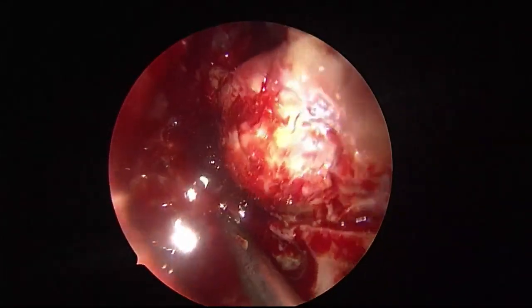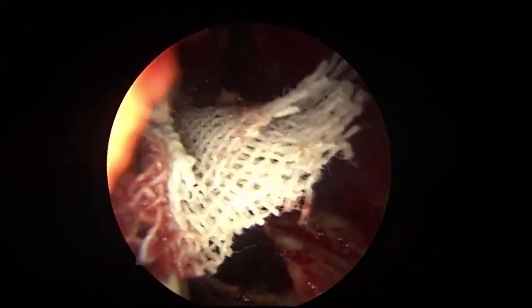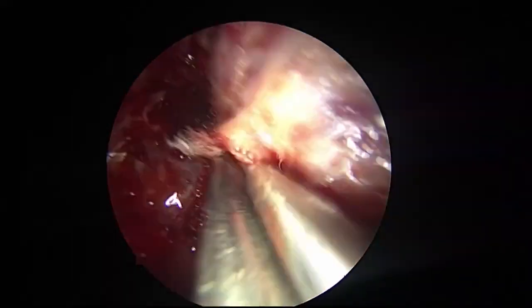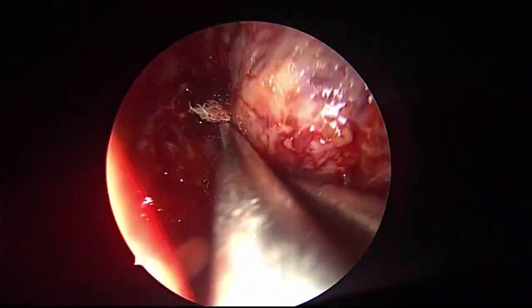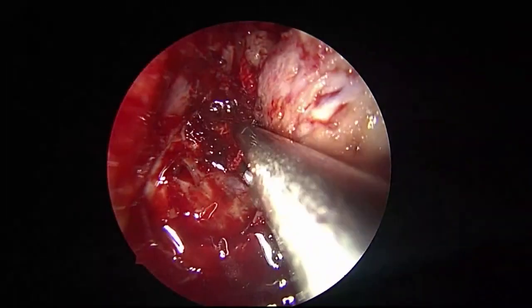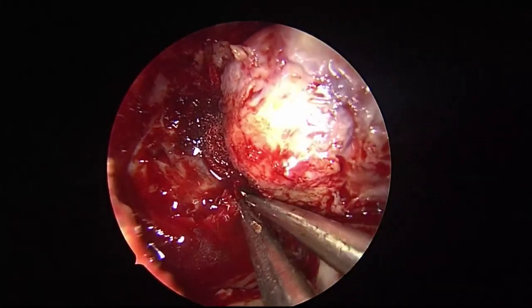This is very, very important. On the tumor surface, if there is the slightest oozing, better to keep the Surgicel and then keep it pressed with the gauze. See like this? Yes, sir.